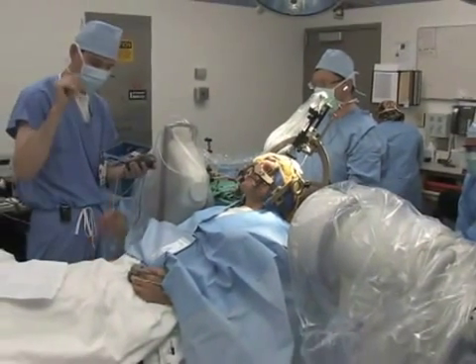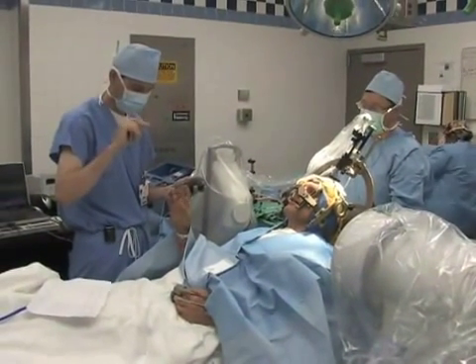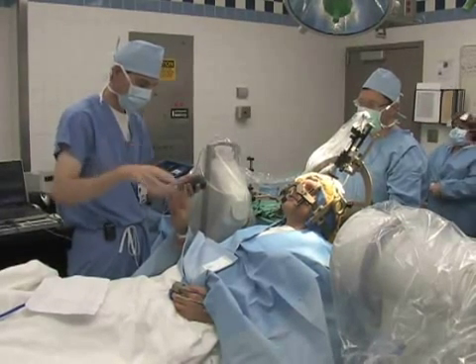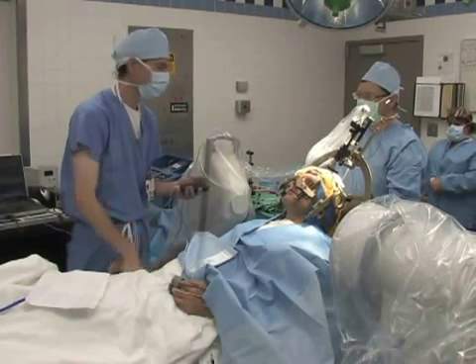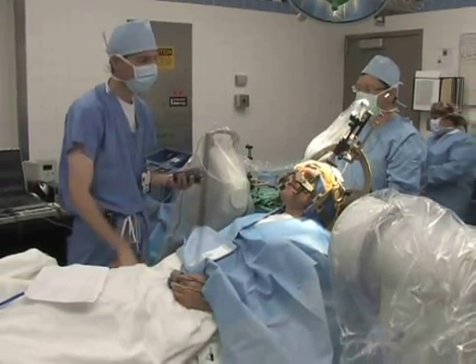Make your right hand open and close as fast and wide as you can. Now relax. Rigidity is a little bit better — about where it wasn't going to be affected, it's actually a little bit better.